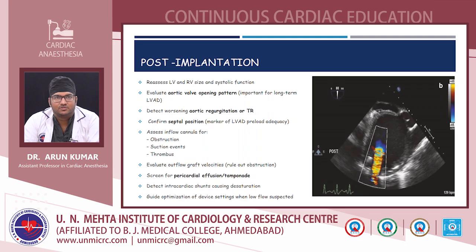And we are supposed to confirm the septal position and assess the inflow cannula for any obstruction, suction events, or any thrombus. And we are supposed to evaluate the outflow graft, and if there is any turbulence, we are supposed to rule out any obstruction and screen for pericardial effusion or tamponade, and detect any intracardiac shunting causing desaturation. And it also helps in guiding the optimization of device settings when low flow is suspected.